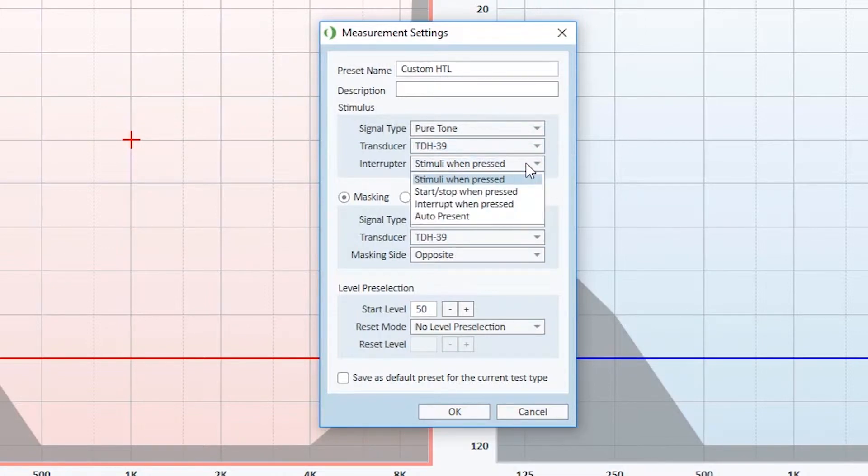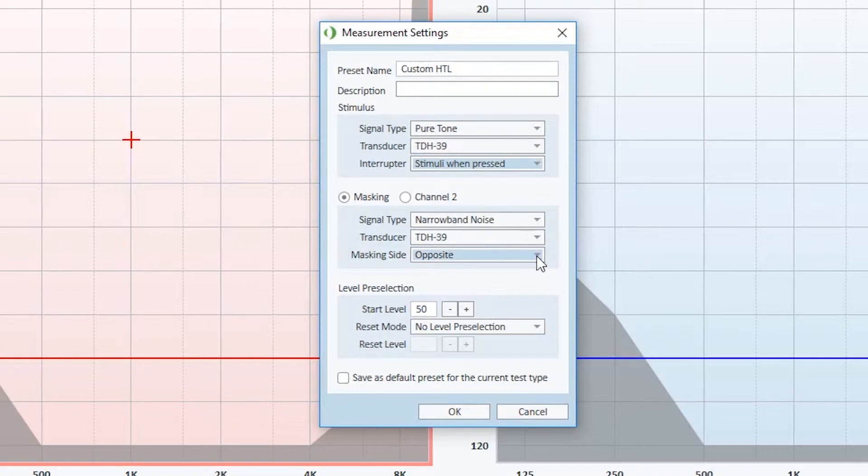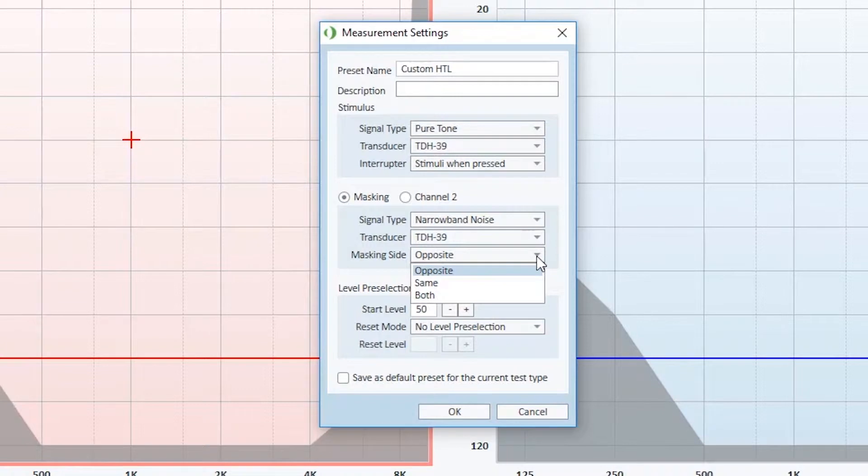The masking channel can be configured likewise. For example, what signal type and transducer to use, should the masking be on the same or opposite side, or on both sides? Level preselection when the test starts can also be set from here.